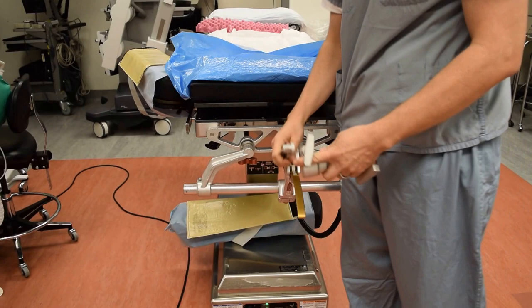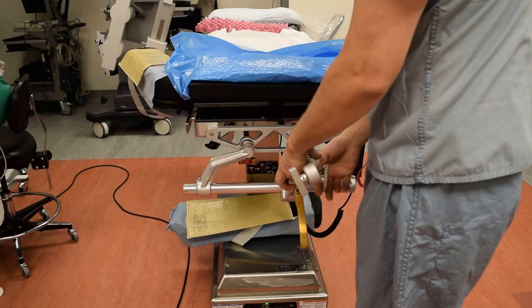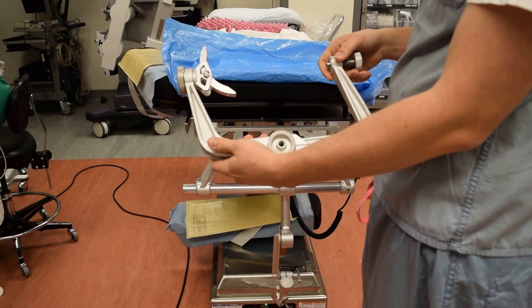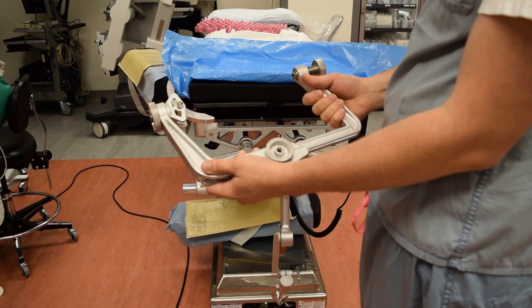Then we have this adapter, which is going to screw in like so. All of these should be loose so you can manipulate the angles before we pin the patient. Lastly, we have the Mayfield pin device. Before we come in the room, the nurse or the resident is going to get the sterile pins. We put bacitracin inside the caps of the pins so the tips of the pins are coated in bacitracin.